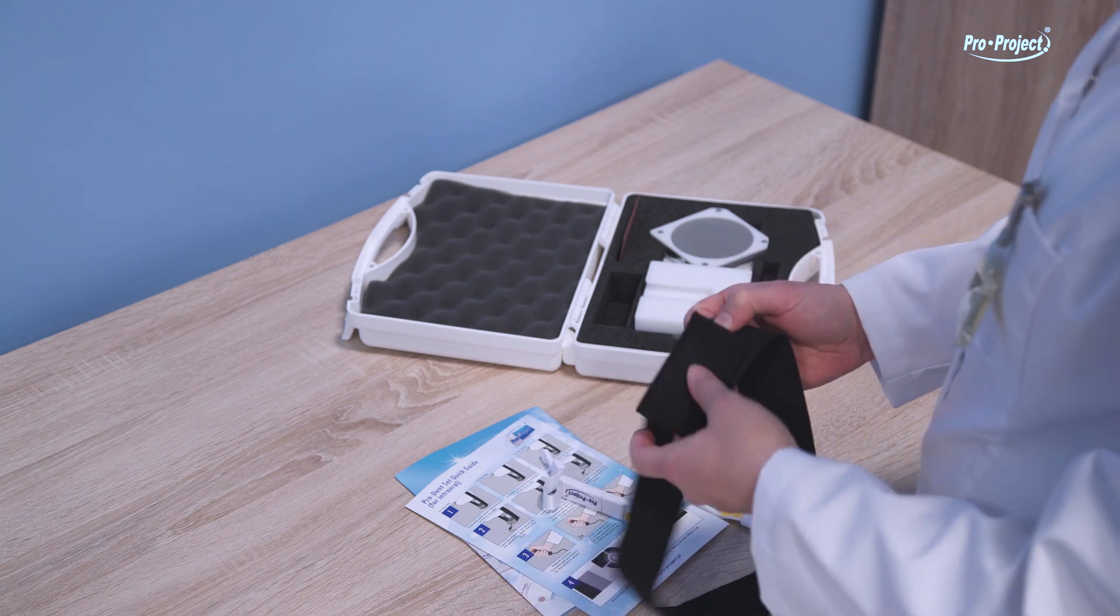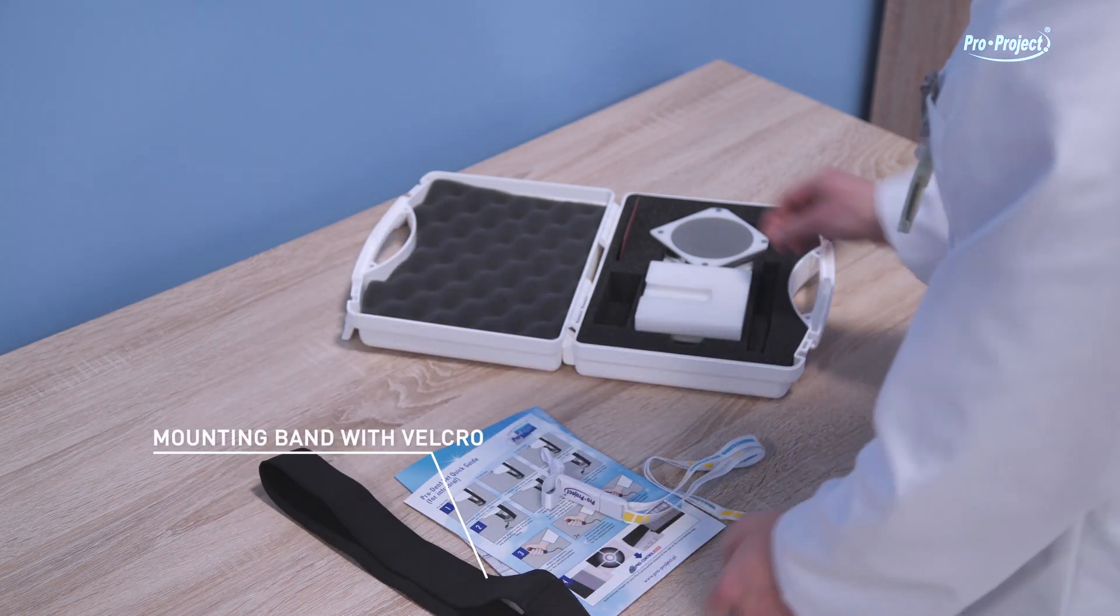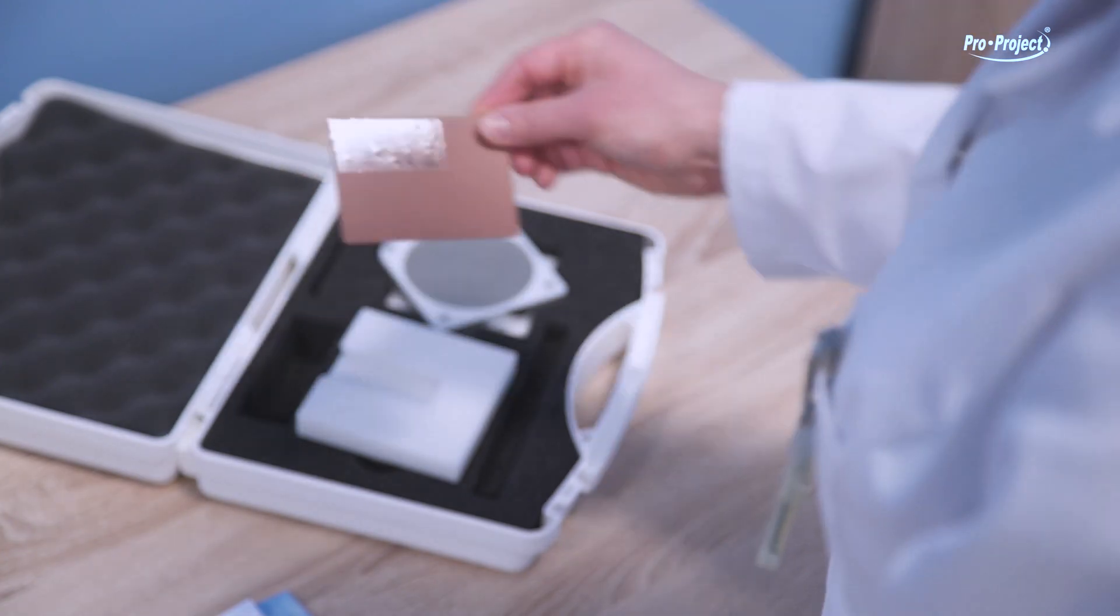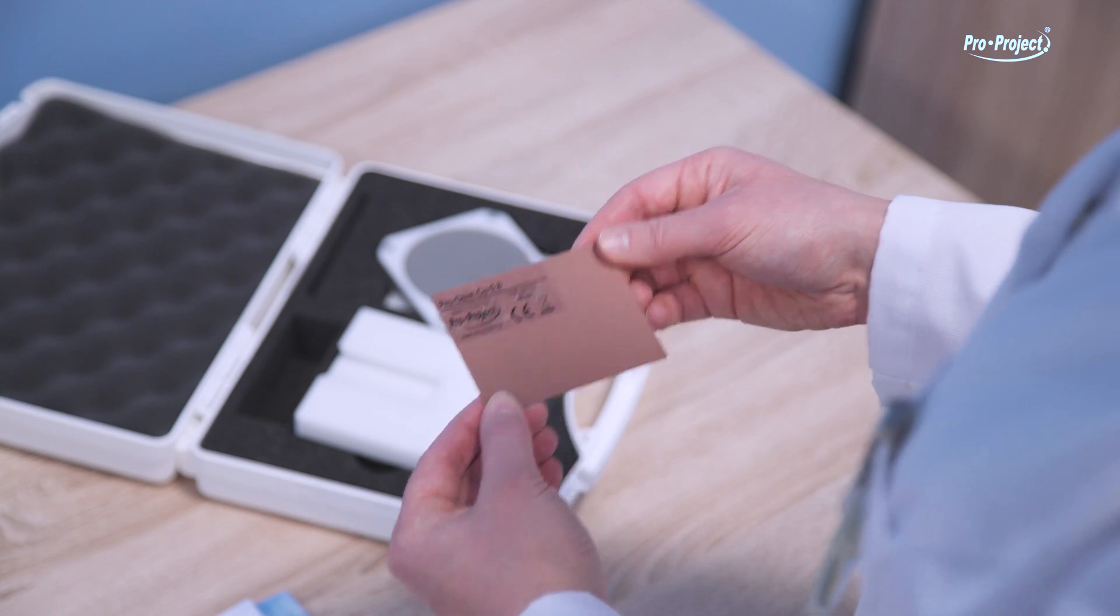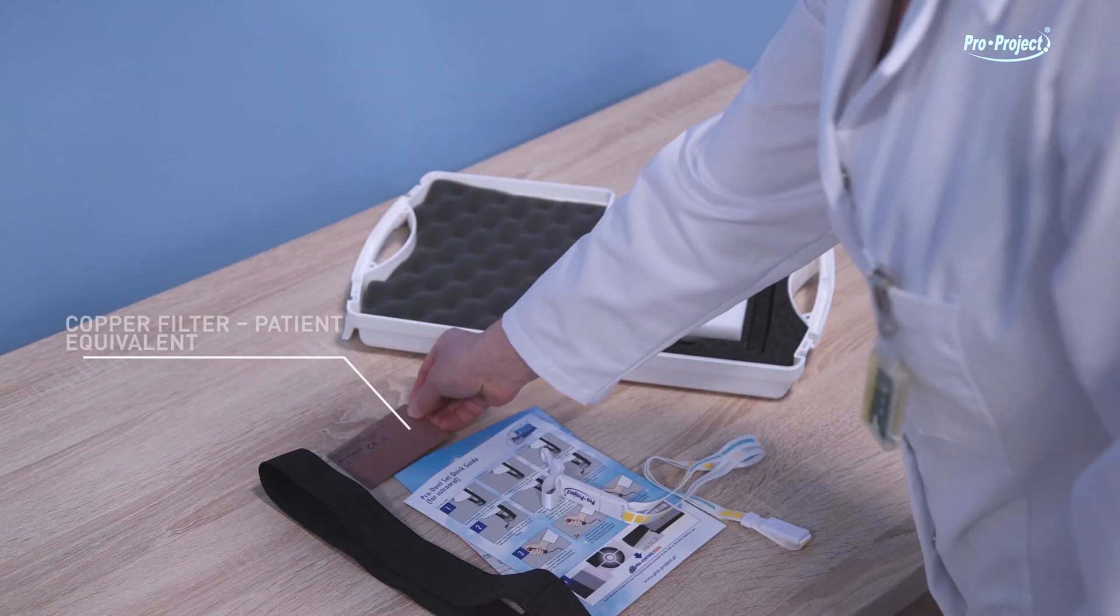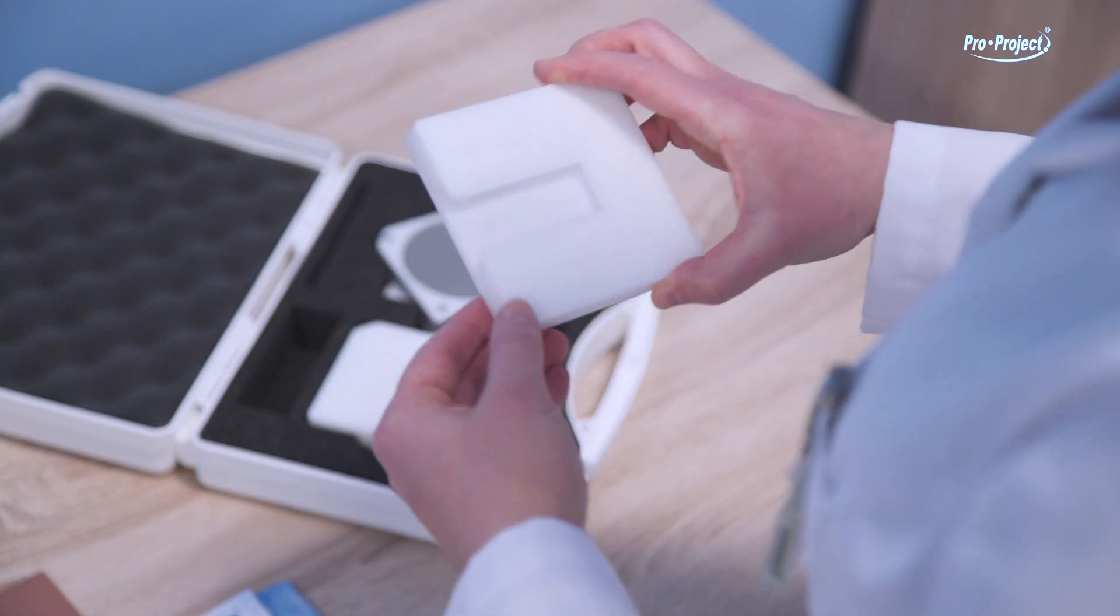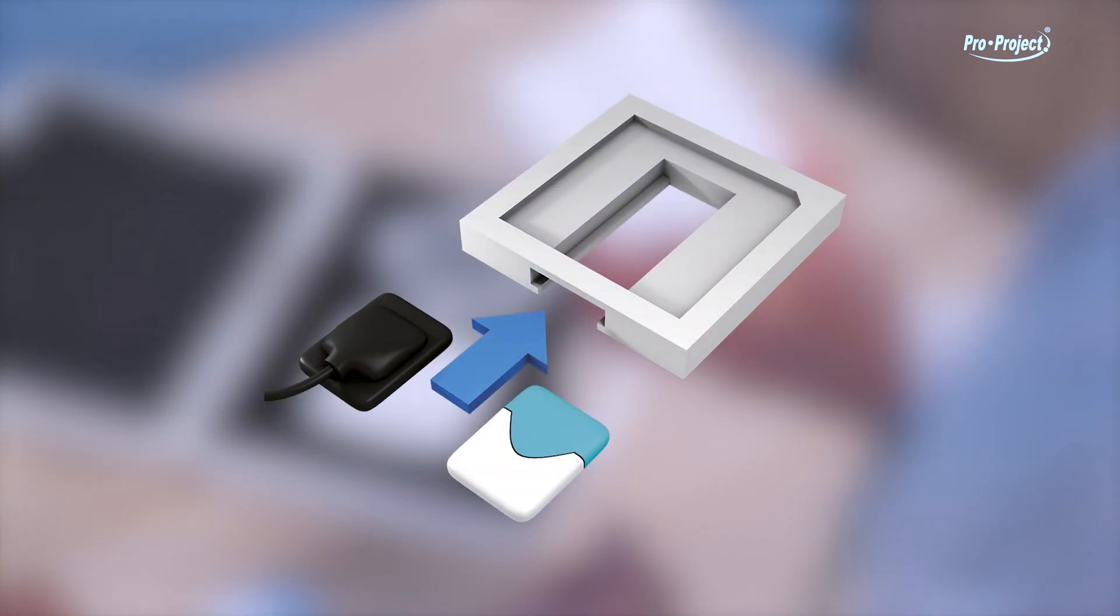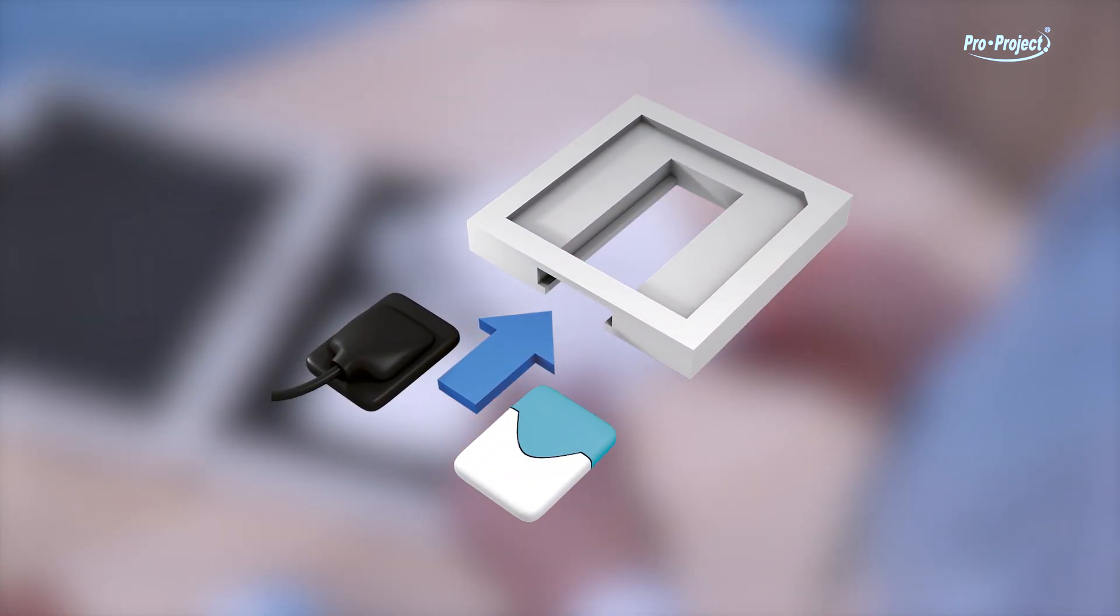Mounting band with Velcro. Copper filter patient equivalent. Positioning base with place for an analog film or digital sensor.